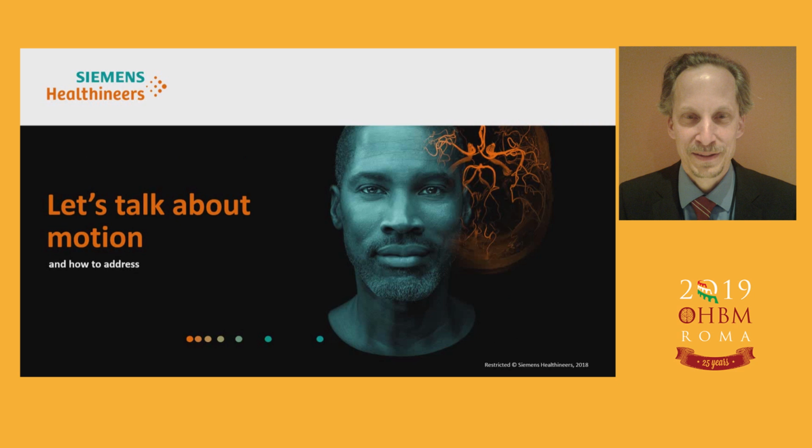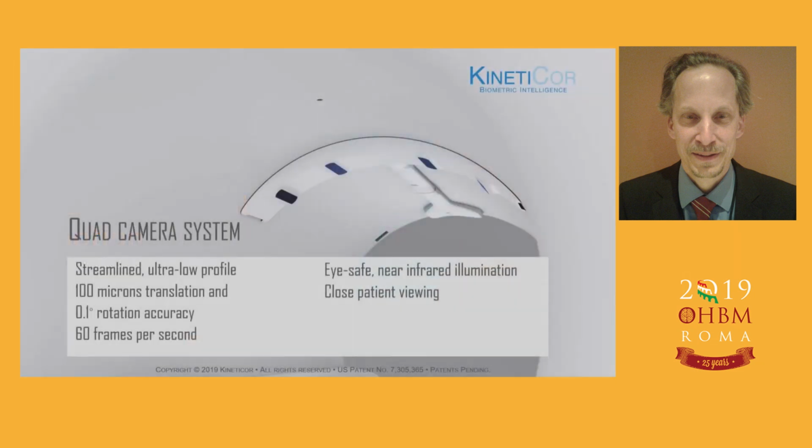I want to talk about motion, and especially how to address motion. This is something which really affects everybody of us, no matter if you work on a 1.5T system, a 3T system, or a 7T system. Motion is really a crucial thing to address. Otherwise, we need to do rescans or we have problems analyzing our data. So there are a lot of things we need to think about.